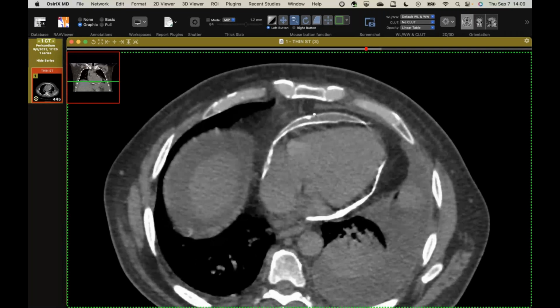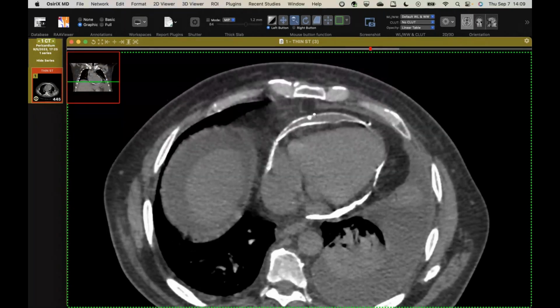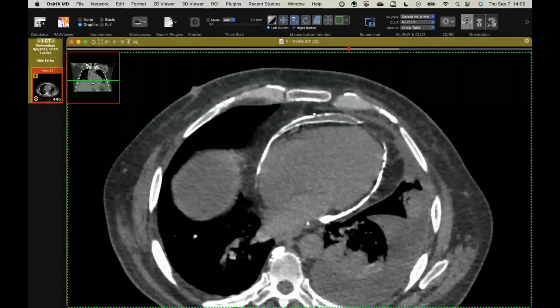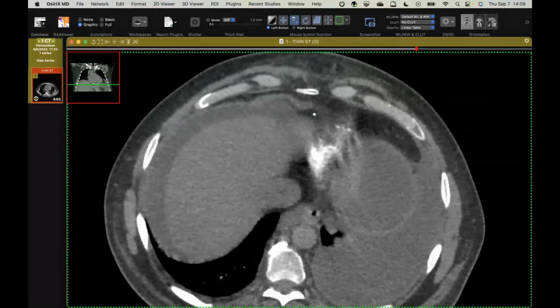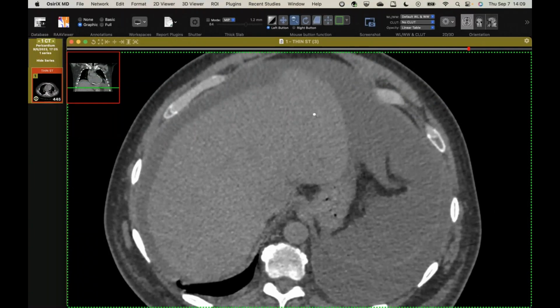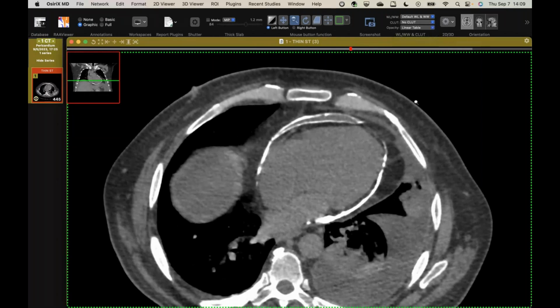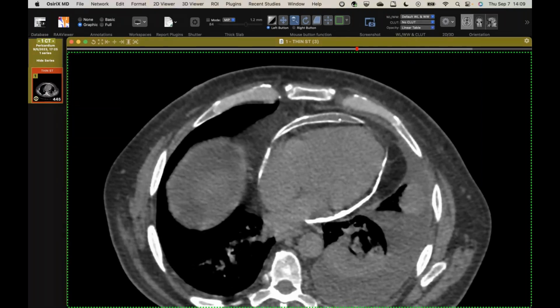And you see the dilated IVC. They're not huge. The SVC is normal, but you can imagine this is causing quite a bit of constriction. There's ascites, presumably all related to some pleural effusions. Unfortunately, there is no radiograph because it would be really pretty to see this. But I like this one in particular because you can see the separation of the two layers with this milk of calcium in there.